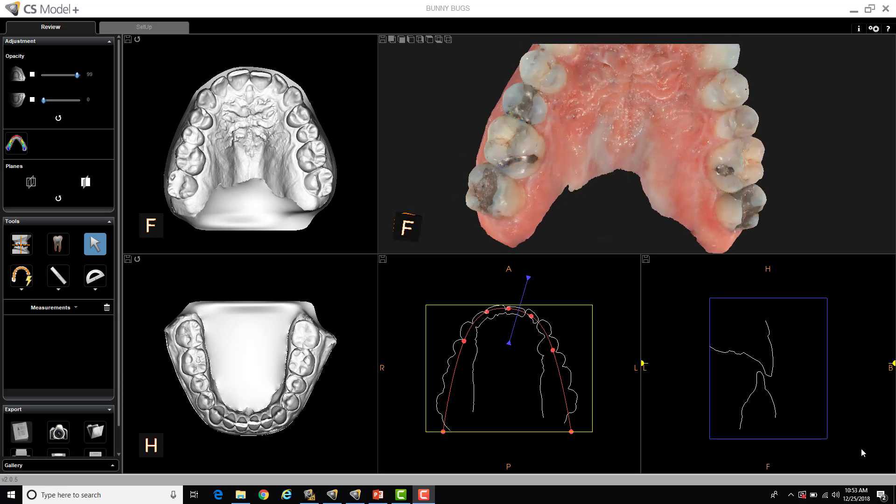The other nice thing about this workflow is, if you treatment plan this patient for a crown in the next couple of weeks or so, when they come back in, you don't have to take a full impression over again. You can simply import that same scan back into the software, digitally cut out the tooth or the teeth that you're going to prep, and then you simply scan the prepped teeth that day. The rest of the scan is done, so it makes the workflow much faster, much easier.